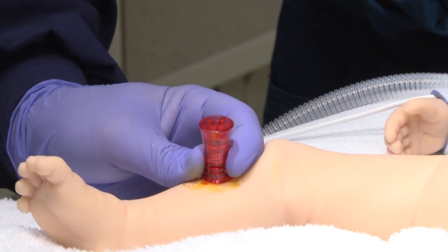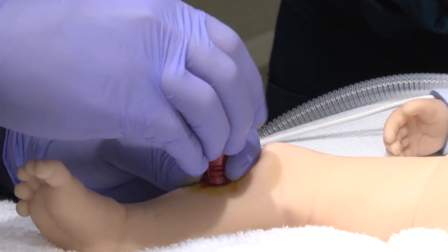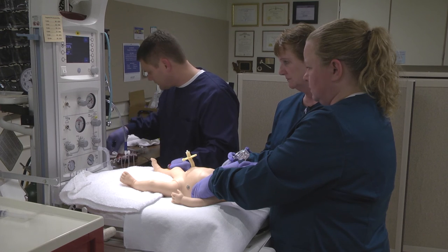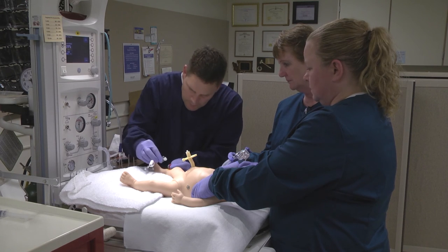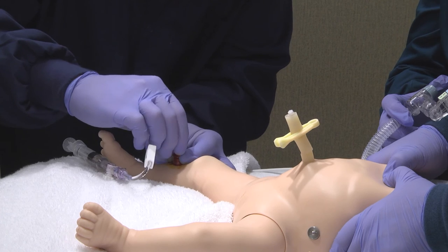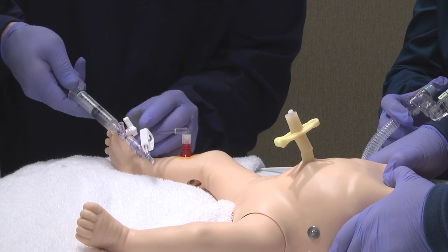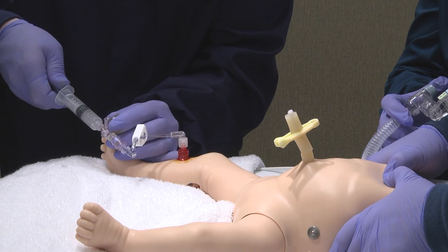Follow the manufacturer's instructions for removing the stylet and securing the needle. Connect an infusion set to the needle's hub. Open the stopcock toward the needle.